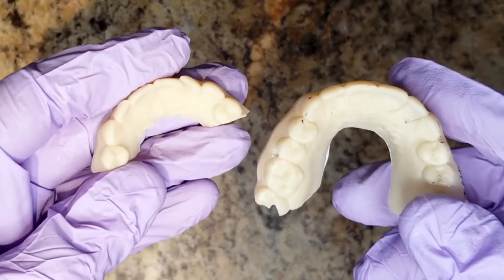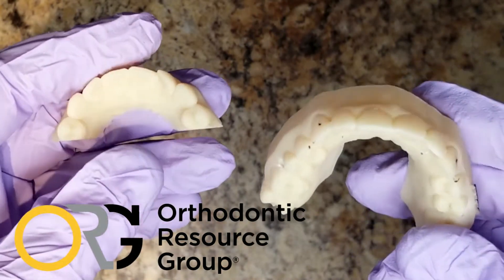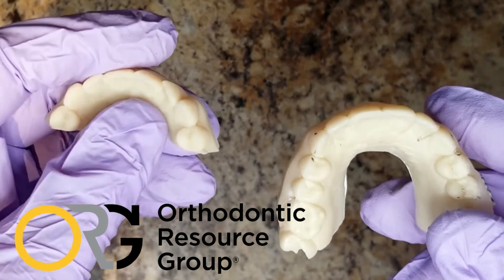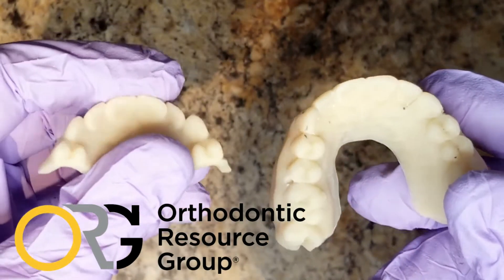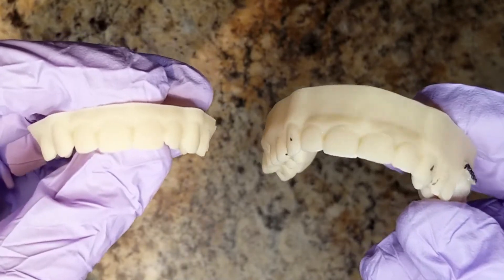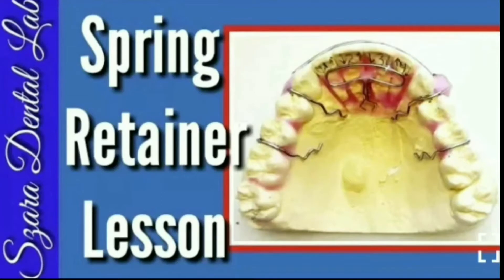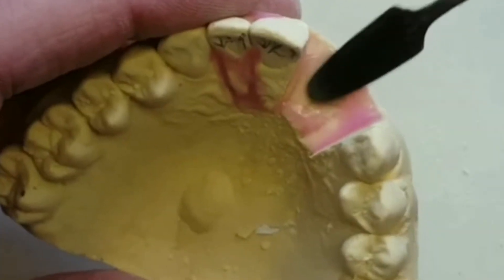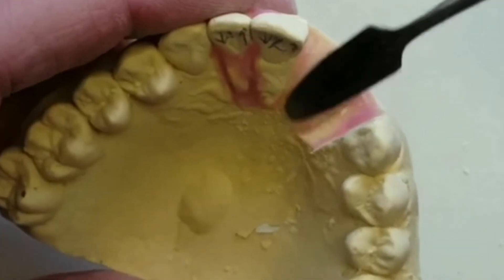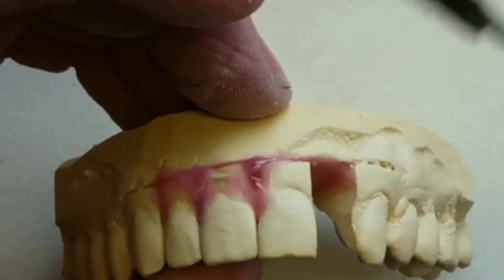Hi everybody, Steve Zara here from Zara Dental Lab, and welcome back to the lab. I'm going to demonstrate how we've gone from the world of analog to digital and the benefits it's creating in the laboratory business and helping orthodontists around the world. A few years ago I made a series of videos on how to make spring retainers using the traditional methods — cutting all the teeth out, resetting the teeth, bending the wires, making the appliance — methods that have been used for years.